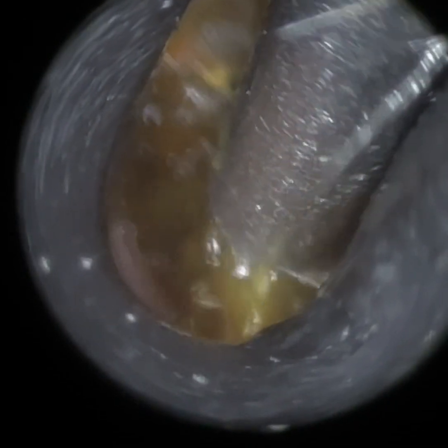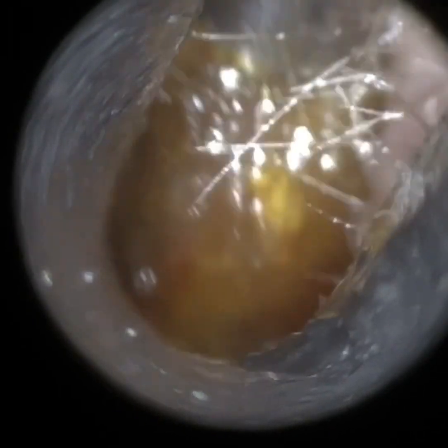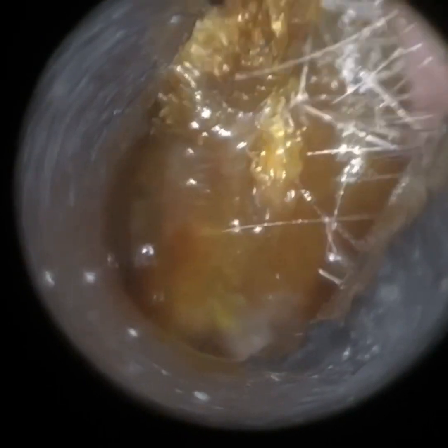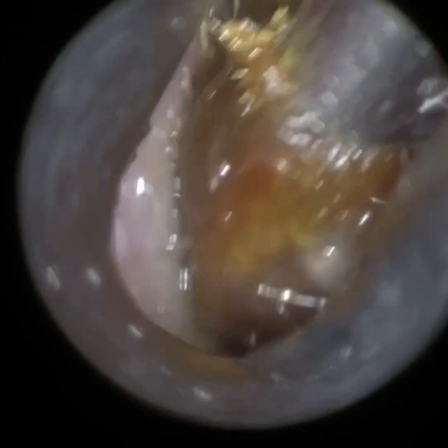This is probably where some people will find it difficult to use our iClearScope Endoscope, because you're having to dilate and stretch the ear using the endoscope itself and at the same time visualize the wax and use your other hand simultaneously to remove the wax. It was just stretching and straightening the ear that some people found a bit difficult to use with the iClearScope. And that was the reason why I decided to develop the Waxscope as well, as a complementary or alternative device to the iClearScope.